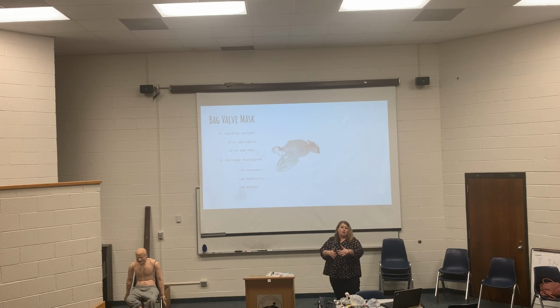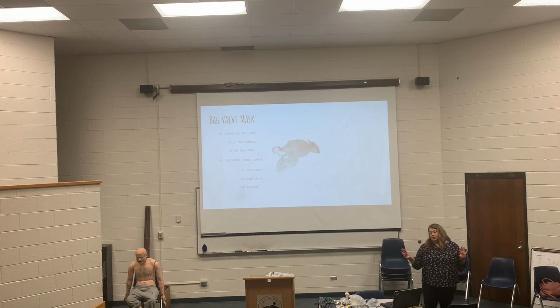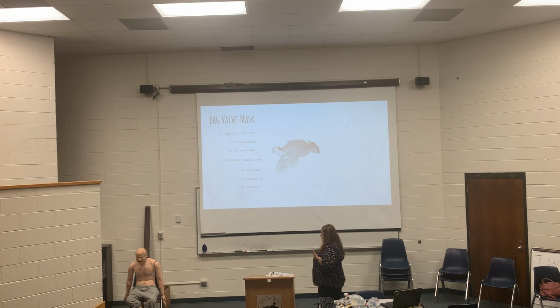So there's a lot going on. Can you really sit there and count seconds, or you just don't? So the monitor is amazing for that, because you can bag them, and it not only gives a number on there, but it also will give you the range, and you wanna do between 35 and 45.